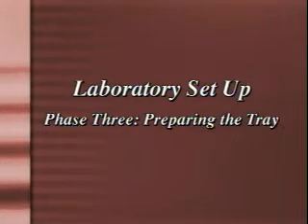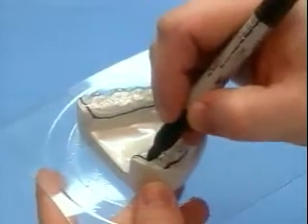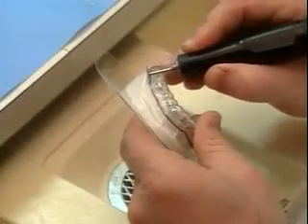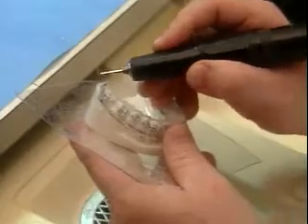Laboratory setup. Phase 3, preparing the tray. Indicate the trim line on the model. Carefully trim the tray material. Avoid bracket hooks with the burr.